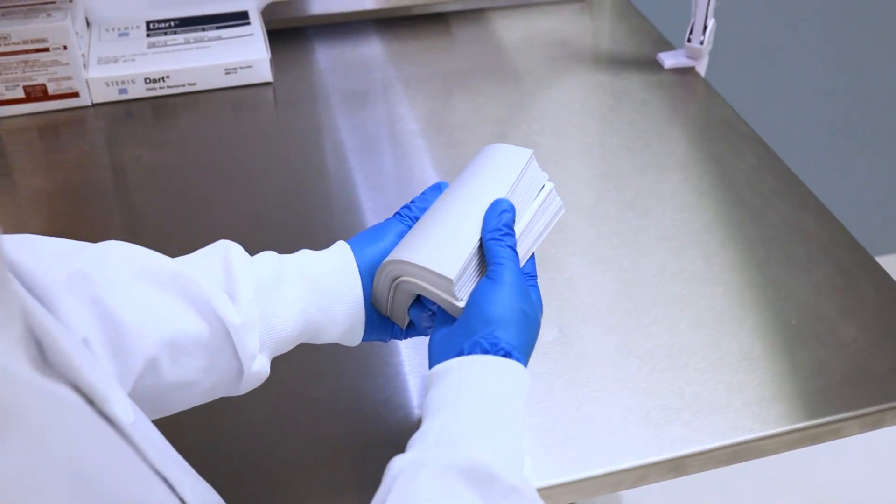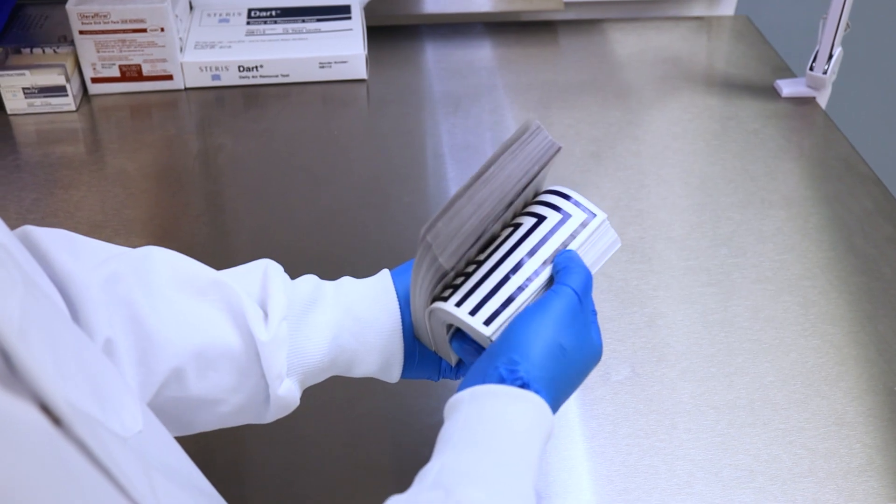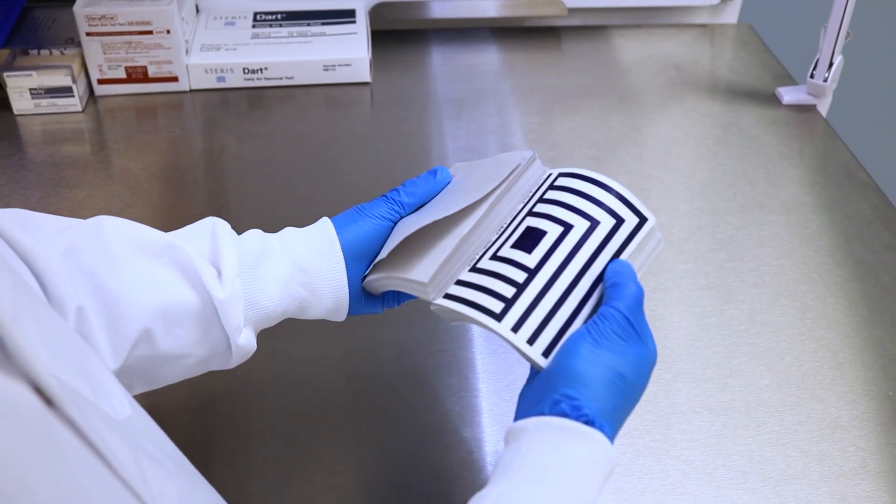Uniform change from yellow to blue indicates adequate steam penetration. Any remaining yellow is considered a failed test.